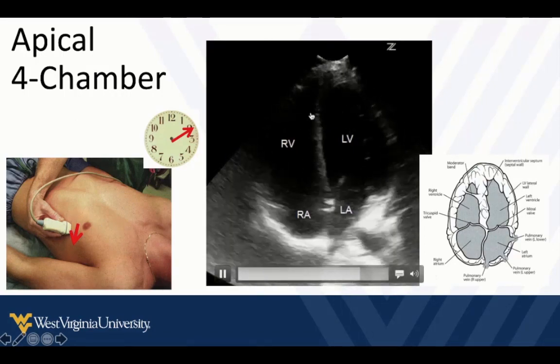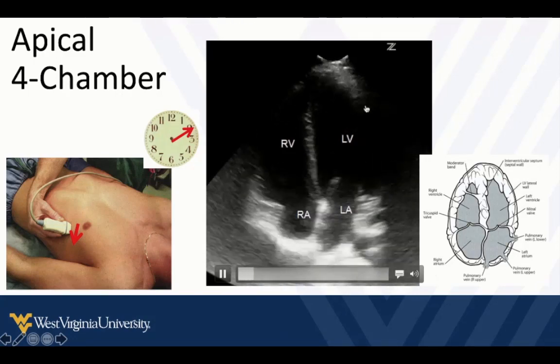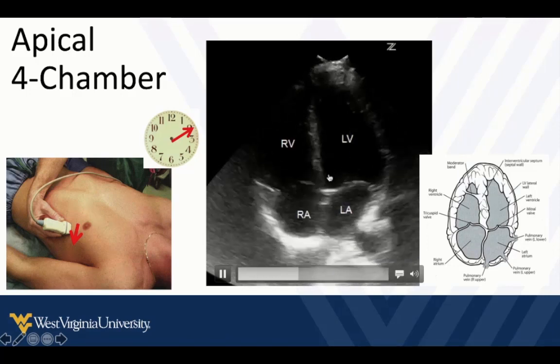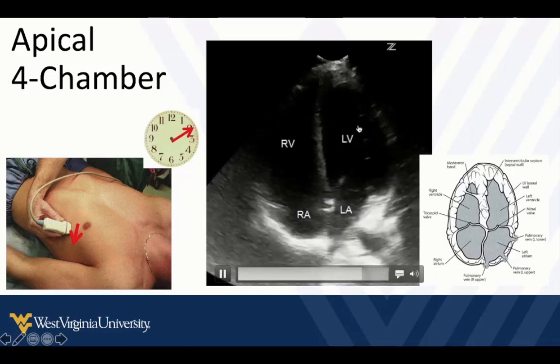We can't just rely on where the chambers are on the screen — we have to recognize the differences. The left ventricle is more bullet-shaped with a slightly wider diameter. If we flatten our probe out, we'll see the aortic valve exiting the left ventricle, and those are clues to which side is left.